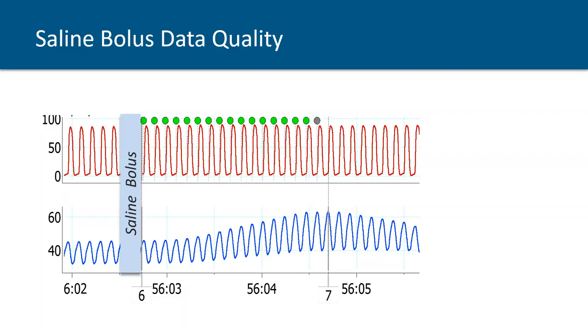And you can see on top there the left ventricular pressure, which is a pretty good guide, or you can use dP/dt to see if you're actually altering the loading conditions when you're injecting your saline. The hemodynamics need to be absolutely stable while the saline is washing in, so that essentially all you're doing is altering the blood properties, the resistivity properties of the blood.